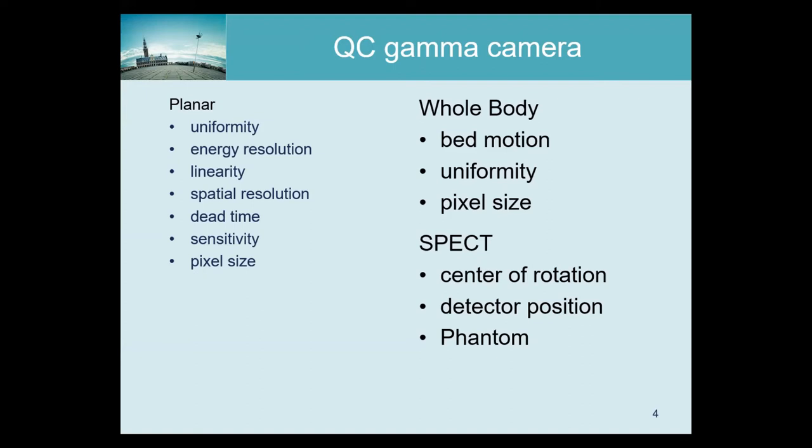And in the beginning of my career, the cameras were very analog. So there was a lot of analog image processing with amplifiers and all that. And the specifications of all that circuitry in combination with the photomultipliers can gradually change, and that would affect the pixel size. These days, everything is discretized very early in the front-end electronics, so the chances of having pixel issues is much smaller now. But still, if the high voltage would change, then the performance of the photomultipliers would change, and that would affect the pixel size.